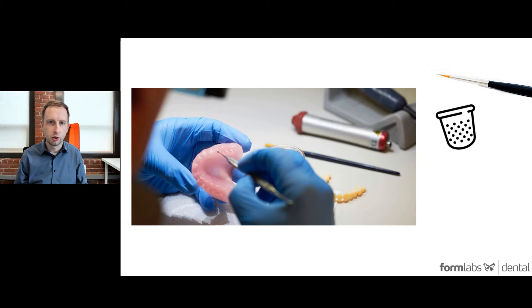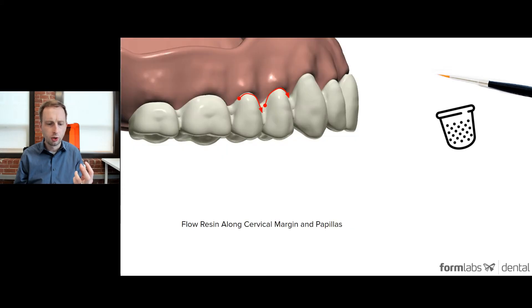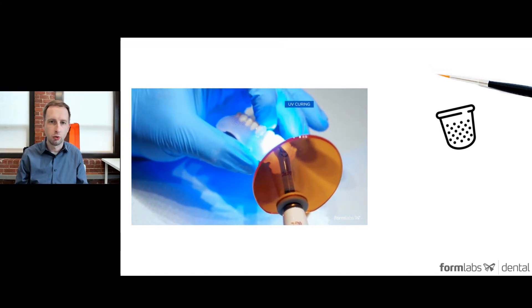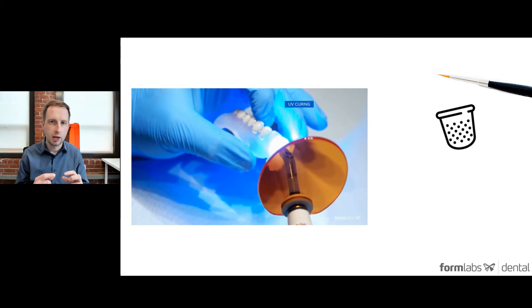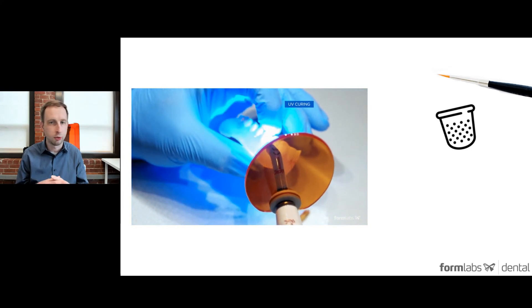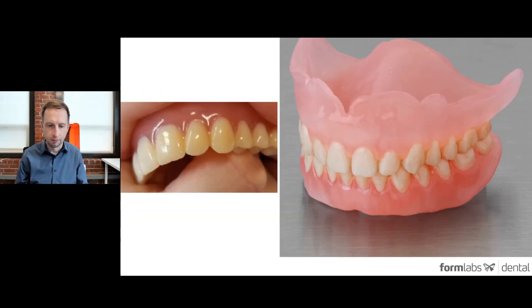After assembly, you combine the parts — the resin overflow is going to squish out a little bit. Before UV curing, take that extra resin and flow additional material into the papillae, redefining that connection and making it look more natural. Once overflow is taken care of and you've added resin where needed, take your handheld UV cure light — part of the normal assembly process — and tack the two parts together, making the resins hard. With this technique, the teeth look more individualized, more personalized, and the papillae and connection to the teeth look much more natural.